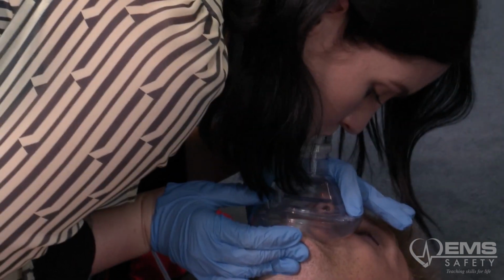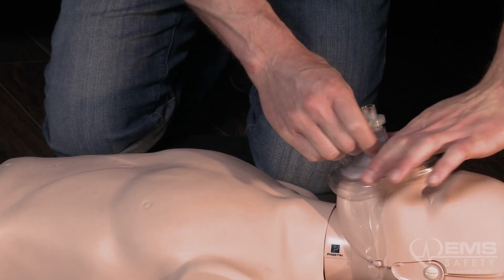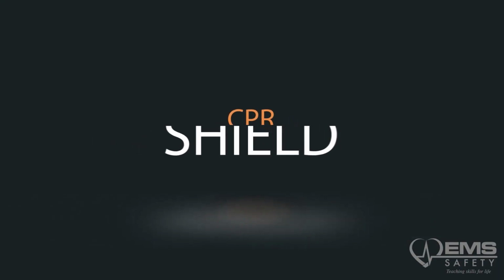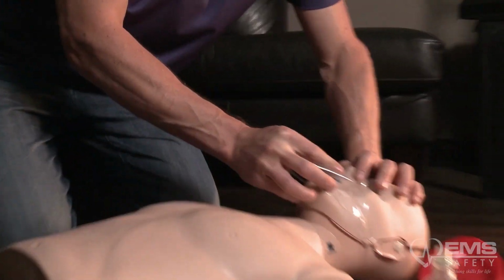At work, you will usually use a CPR barrier. Apply a CPR mask firmly to create a seal when you give breaths. With the CPR shield, pinch the nose while you give breaths.